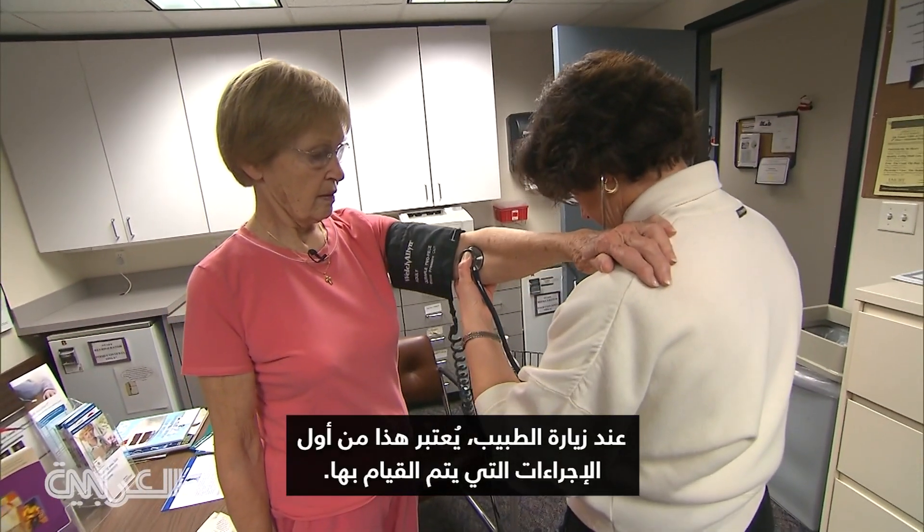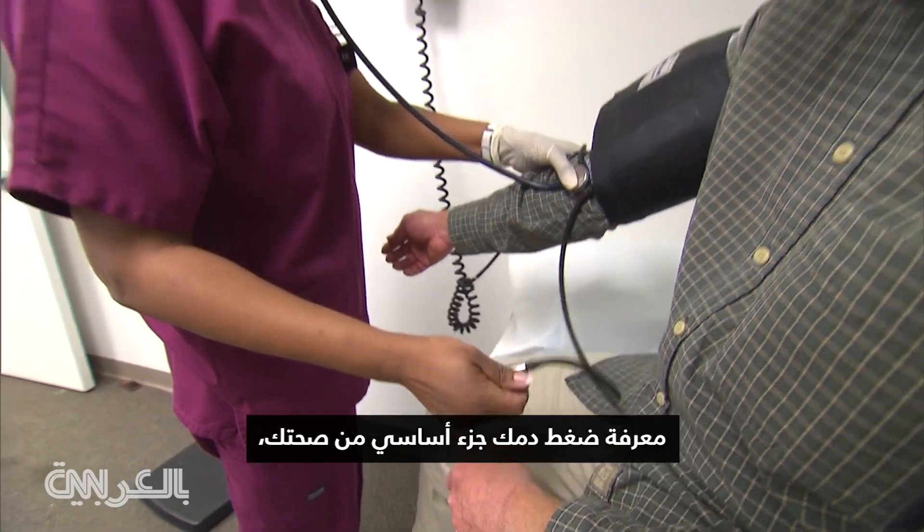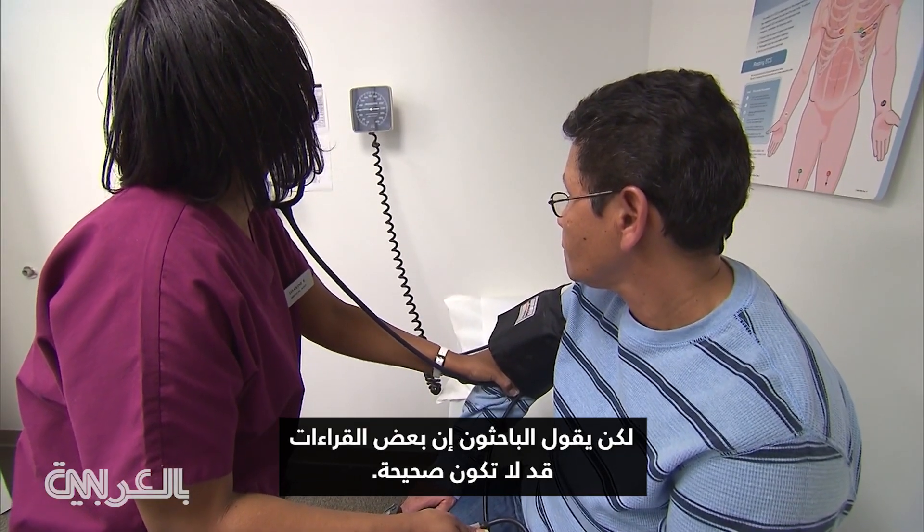At a doctor's appointment, it's one of the first things you have done. Knowing your blood pressure is a critical part of health, but researchers say some readings may not be right.